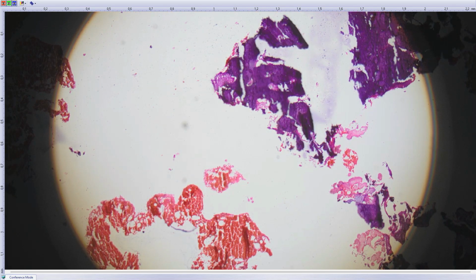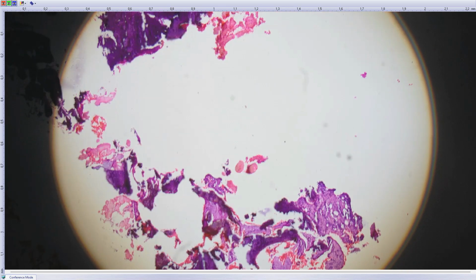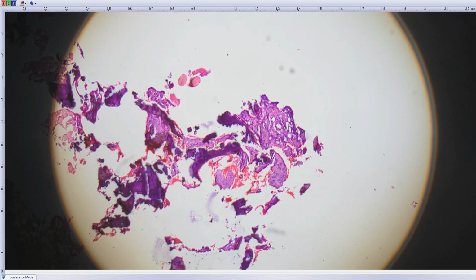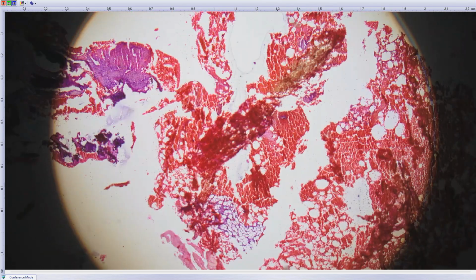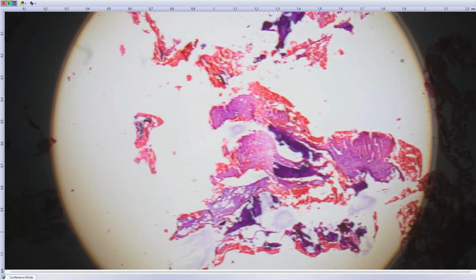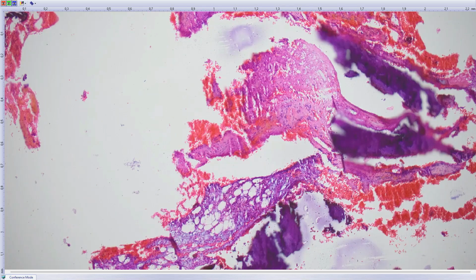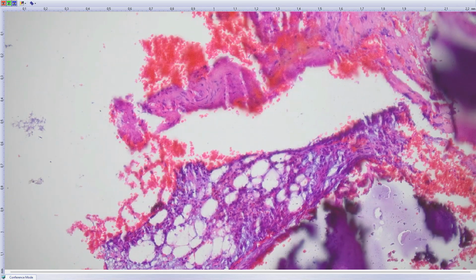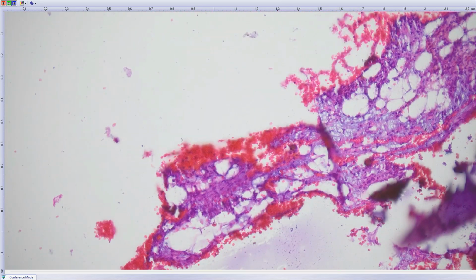So this is a 19-year-old girl, tumor in the metaphysis of distal femur, and we received this very suboptimal, let's say, tissue: fragments of bone, some bone marrow, blood, and some fibrous tissue where occasionally you could track down some perhaps tumor cells that look a little bit like lymphocytes.